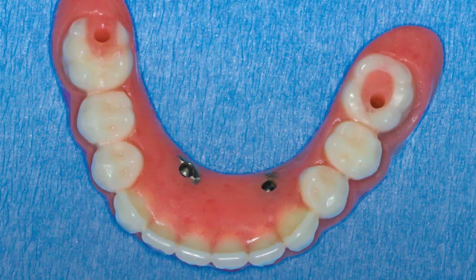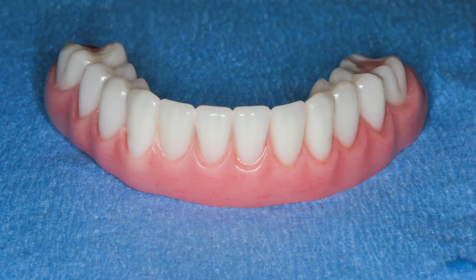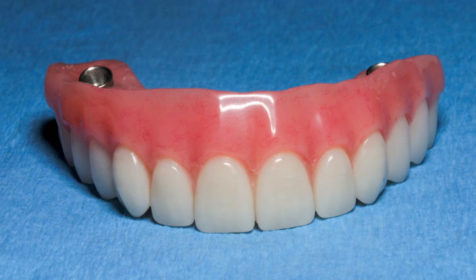The treatment protocol in these cases is essentially the same as that employed for a screw-retained hybrid appliance. After placing the implants, the provisional stage is essential in that it provides the opportunity to work out any movements, protrusions, and excursions that can be difficult for the patient to replicate chair-side. In order to fine-tune the tooth positioning and ensure a prosthetic design that addressed the patient's functional difficulties, a new set of provisionals was produced and worn by the patient until he was satisfied. Because the Bruxer full-arch implant prosthesis is an exact replica of the patient and doctor-approved provisional, all adjustments, no matter how subtle, made during the provisional stage are reflected in the final restoration.